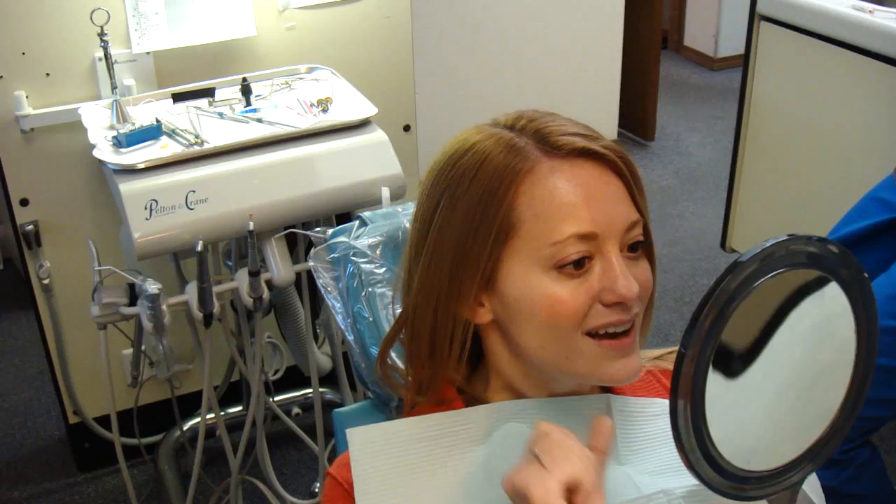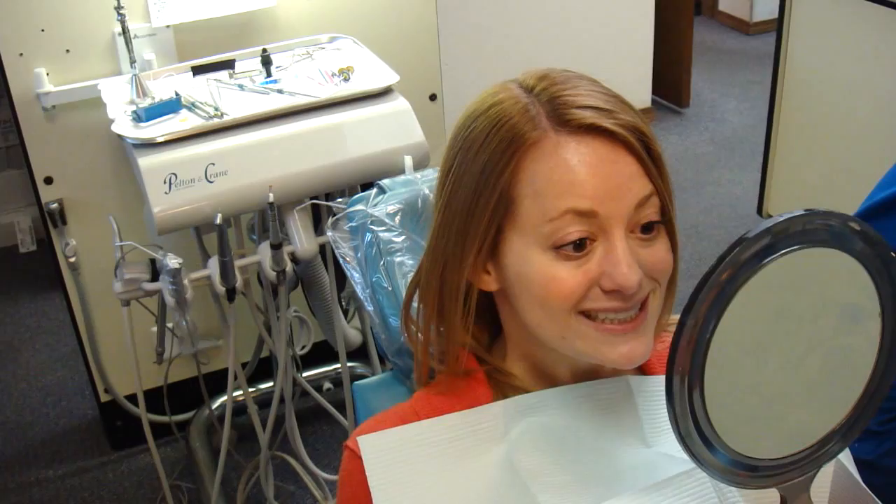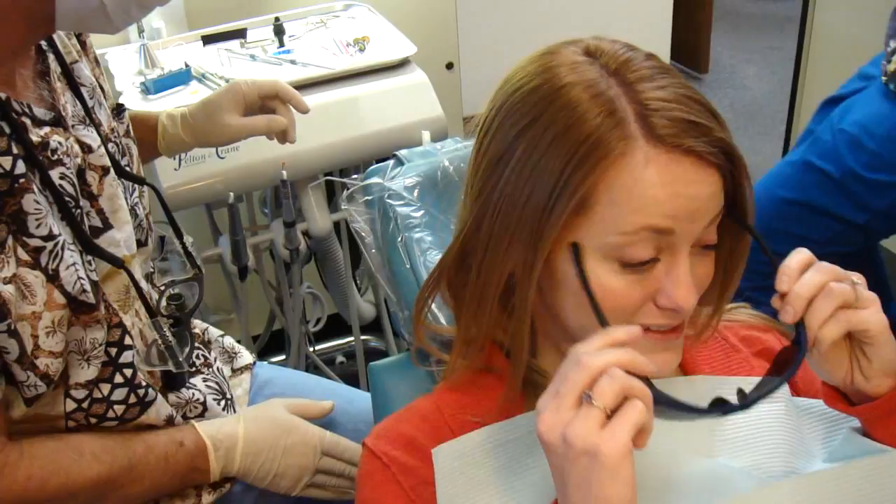I think it looks like, you know, you can't really tell the space we closed. Nothing looks too big or anything. Yeah, it looks really good. I like them so much. Okay, well let's go ahead and bond them on, and now you can go on with them.